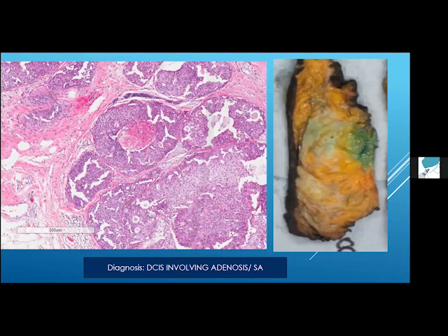Yeah, I agree with you that a panel is always good, but I think that in our practice, we saw some cases that when you stain for myoepithelium, there are just some acini that are morphologically indistinguishable from the rest of it that retain myoepithelial expression at the periphery, where we don't see it. And we usually end up favoring that this is not representing true invasive component.